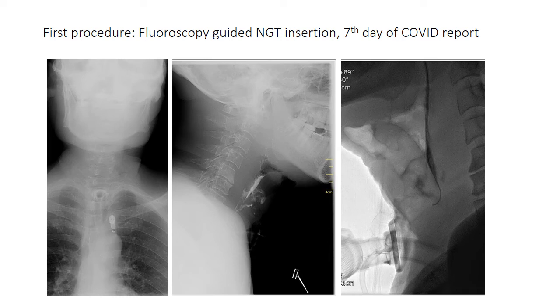We can see an irregular space in the anterior neck, with irregular contrast filling, along with a pharyngocutaneous fistula with contrast egress. Note the guide wire is going into this false space.